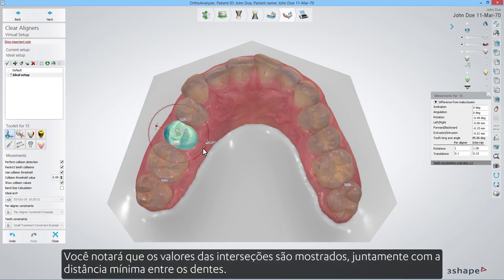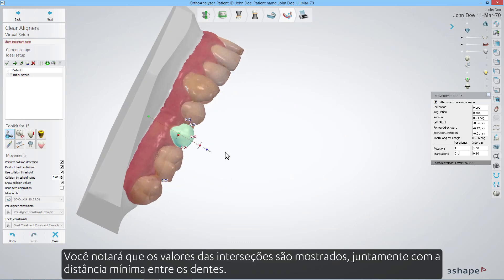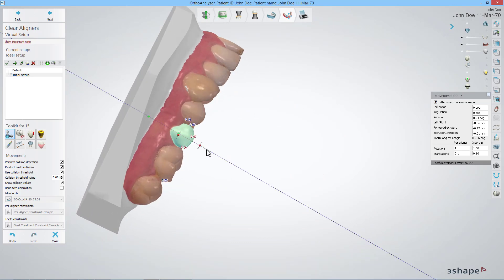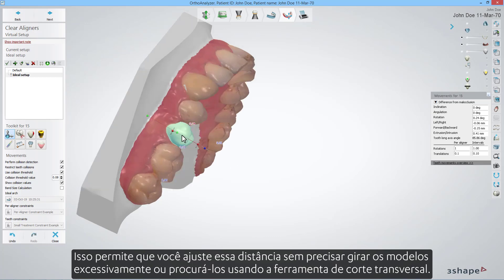You will notice the values of the intersections are shown along with the minimum distance between the teeth. This allows you to adjust that distance without having to rotate models excessively or search for them using the cross-section tool.